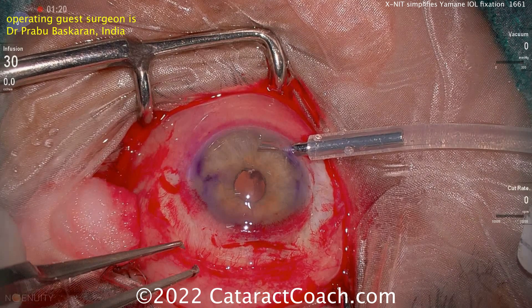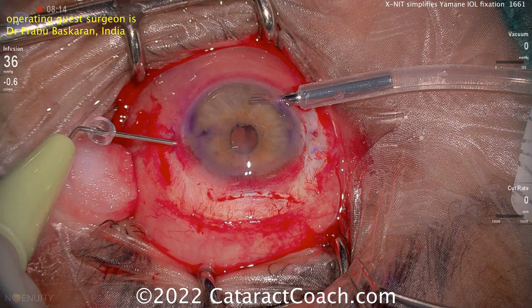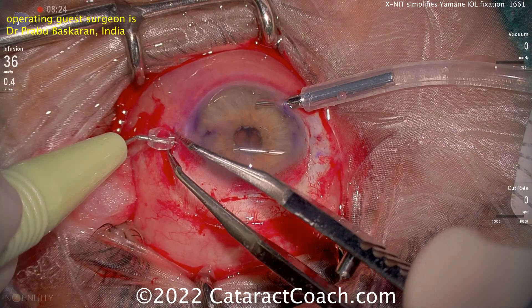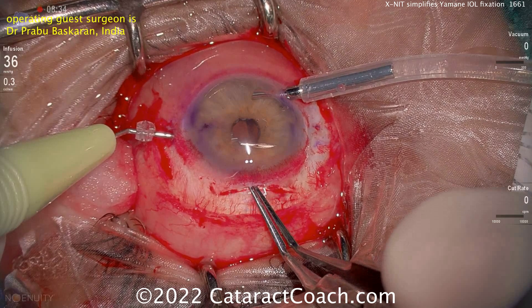Time to pass that needle. Measuring out here, there's the ExNIT measuring device — looks like about one and a half millimeters back. Here comes that hollow bore needle, and you can see it through the pupil. Bring it up through the pupil, and now bring it outside the eye through the main incision. He's got a little stay, almost like a collar — almost like an iris hook — so he can judge the positioning of it.